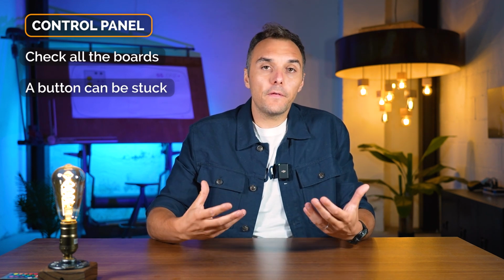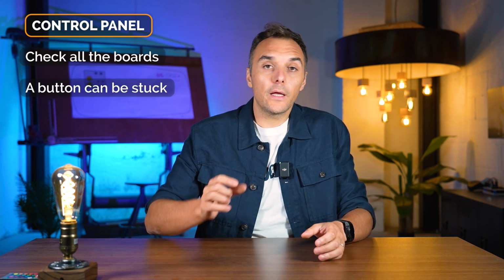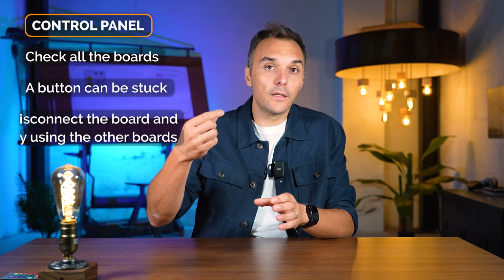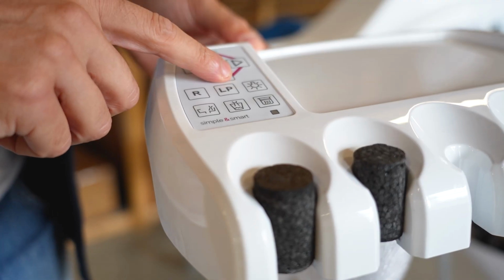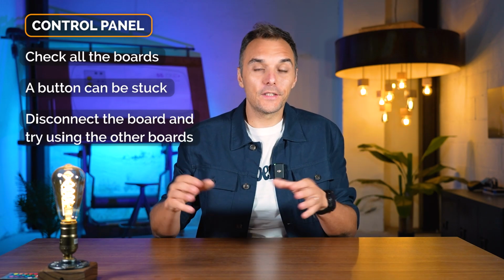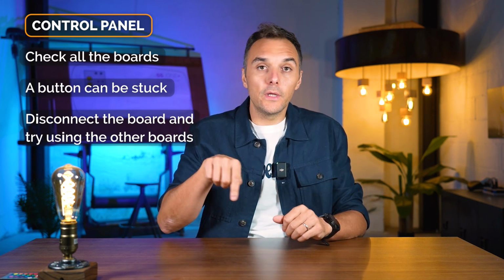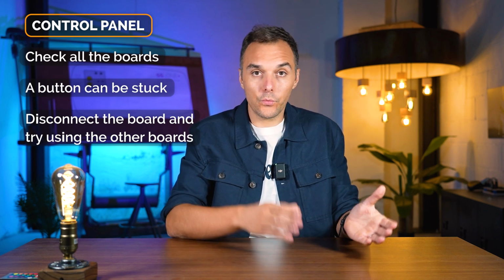So how can we identify whether the problem is one board or the other? Actually, it's quite simple, because you can simply disconnect the board. For example, I'm working near the doctor tray. I see that there is a problem. I can disconnect the doctor board and see if the chair moves correctly by using the assistant board or the switch pedal. In this way, I eliminate one board at least. If I still have the problem, I reconnect the board on the doctor tray and I disconnect the one on the assistant tray. So by doing this on the three boards that we have on the dental unit, we can easily identify where the problem is.